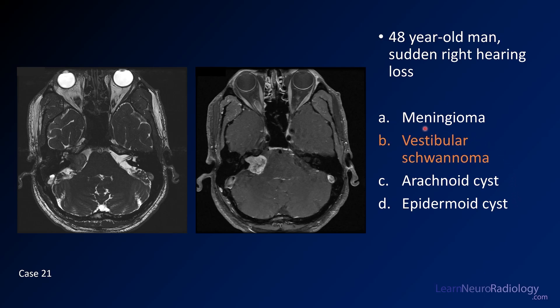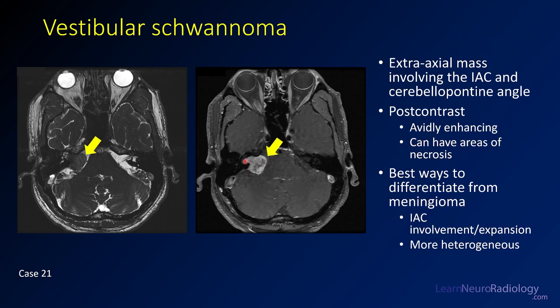The answer is vestibular schwannoma. This is a classic appearance: a mass expanding the internal auditory canal, extending into the CP angle, causing mass effect on the pons and middle cerebellar peduncle. On T2, you can see a nice CSF cleft with the pons, so it's not coming from the pons. The best way to differentiate from meningiomas is involvement and expansion of the IAC. Meningiomas tend to be centered outside the IAC and don't cause that kind of expansion.